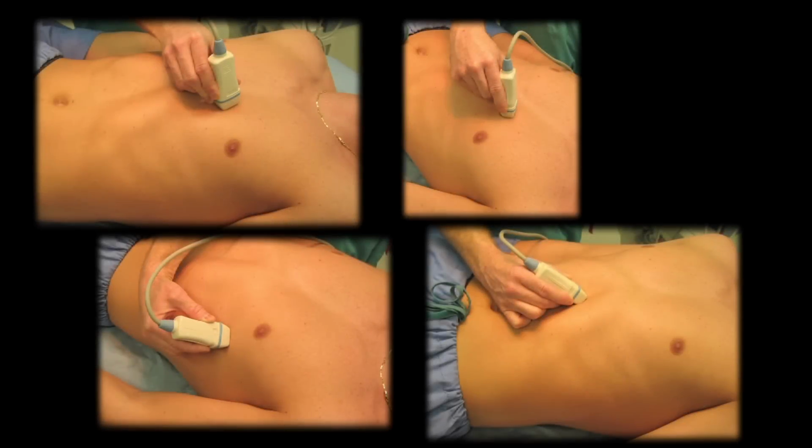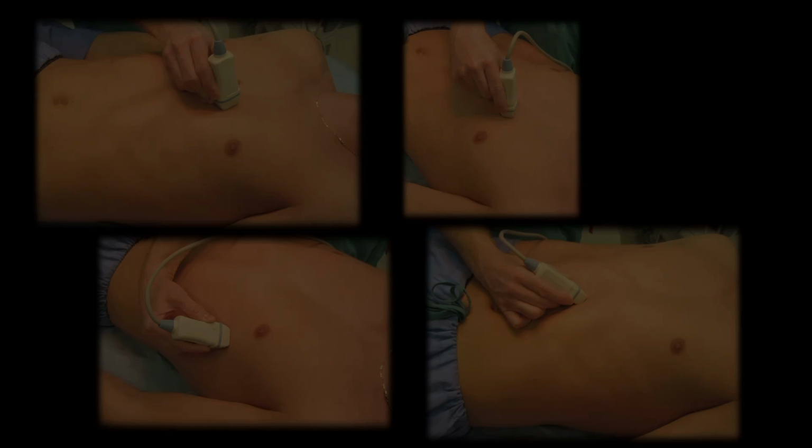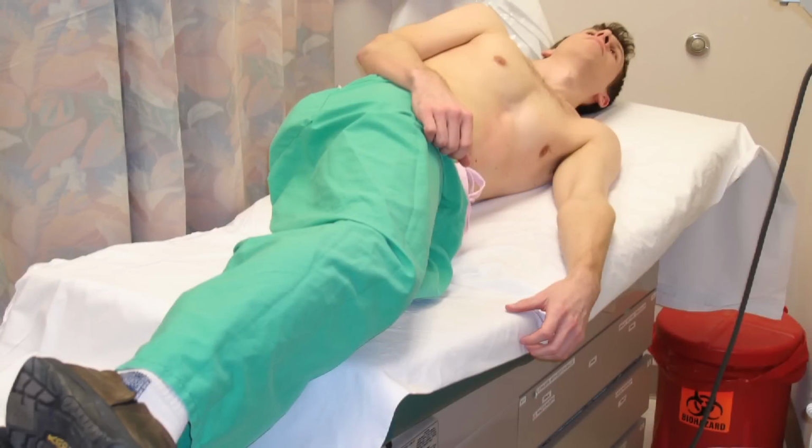There are 4 common probe positions, or views, used for bedside echocardiography. It is important to learn how to obtain all the common echo views because in any given patient, one view may provide excellent information while others are useless. Also, on any given patient, it is impossible to estimate which view will provide the best information. The patient should be in the left lateral semi-decubitus position, but this may not be possible in the emergent setting.